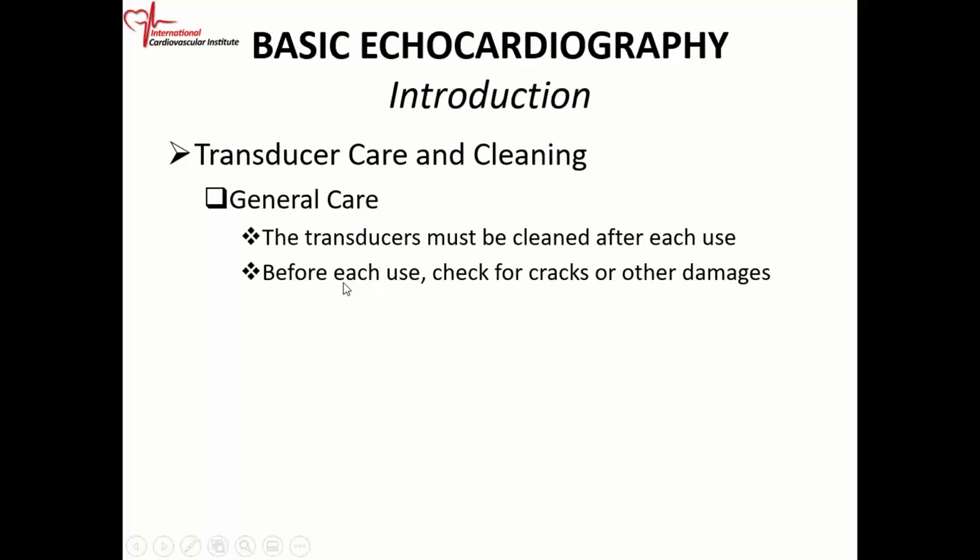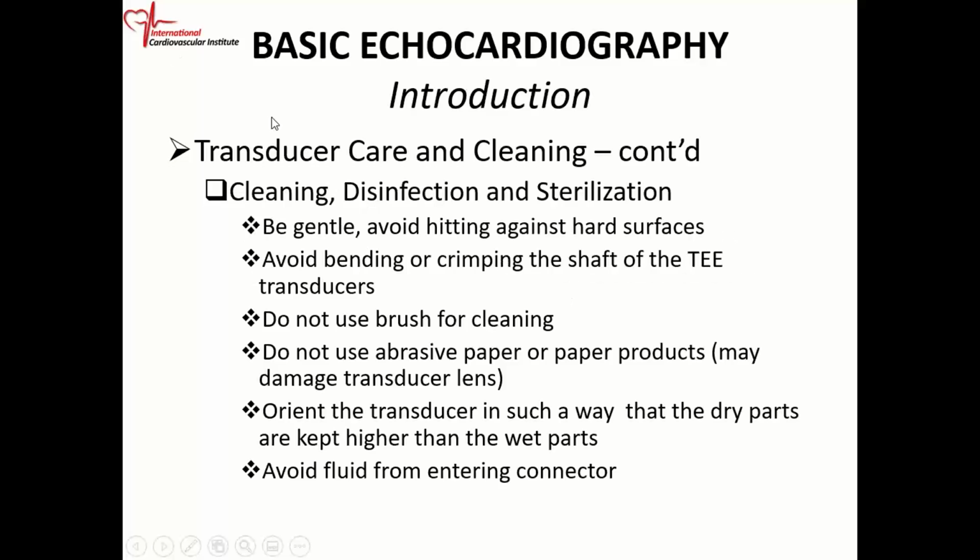Before you use the probe, you should look for cracks or any damage. Some important things: you have to clean the probe, you have to disinfect the probe, and you have to sterilize the probe. You have to be very gentle because these probes can be damaged. With the transesophageal probe, you have to be careful. You don't want to bend it too much, because you can damage the probe.